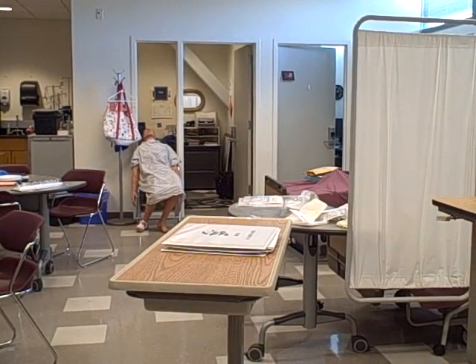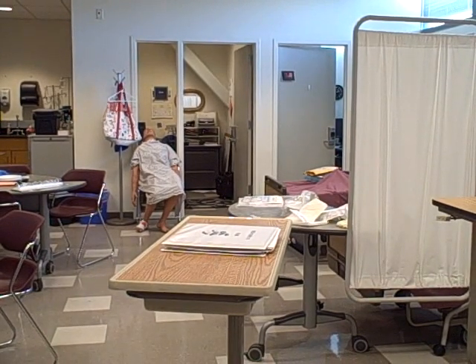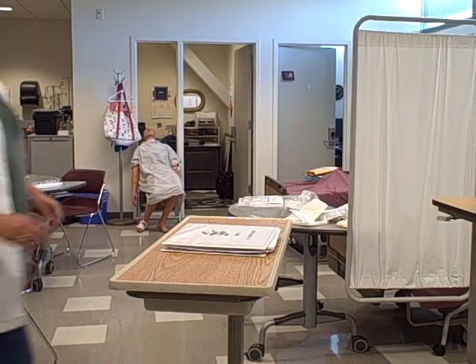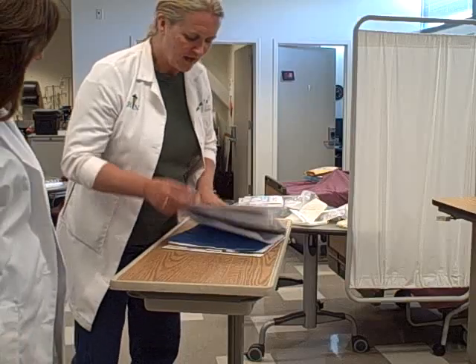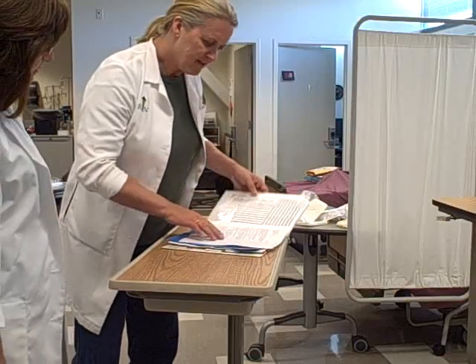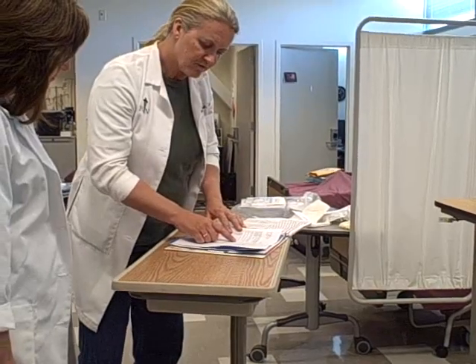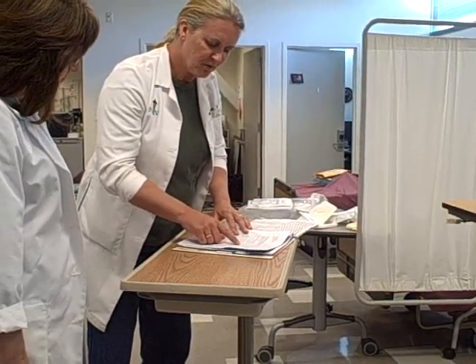This video demonstrates the process of placing a Foley catheter. Professor Carroll, my patient Ruth West has a new order for Foley catheter insertion.